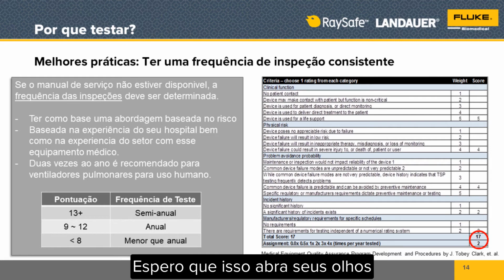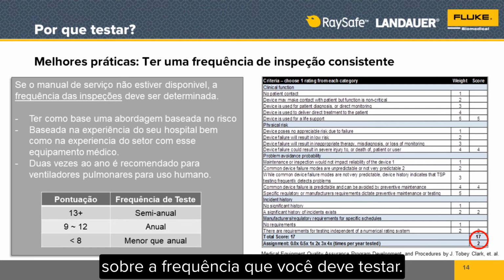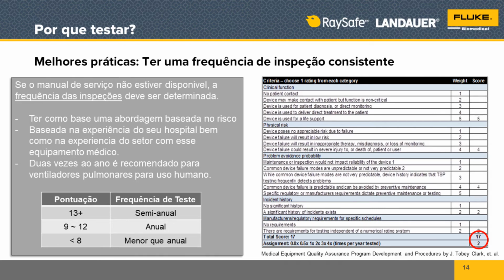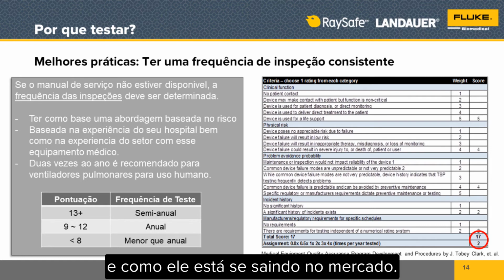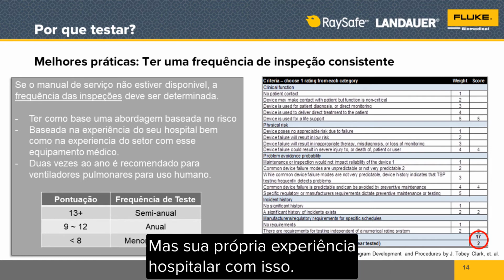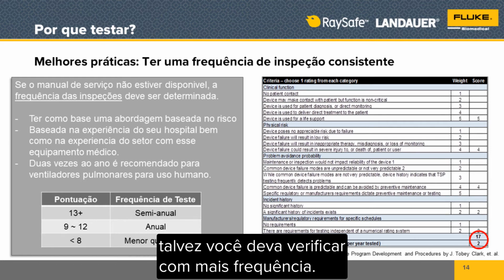I hope this opens your eyes to a different way to think about how often you should be testing, what your test frequency should be, because it does take into consideration not only the medical device and how it's performing out in the market, but your own hospital experience with it. So like I said, if there are some components that fail more often than others, maybe you should check more often.